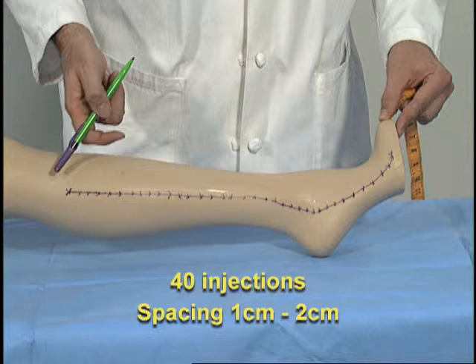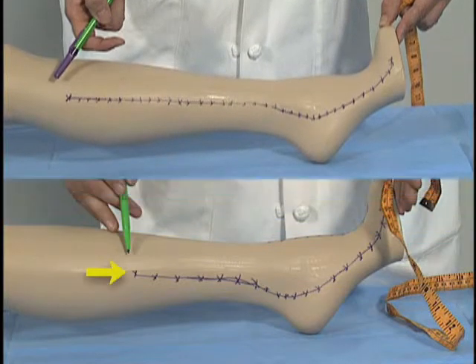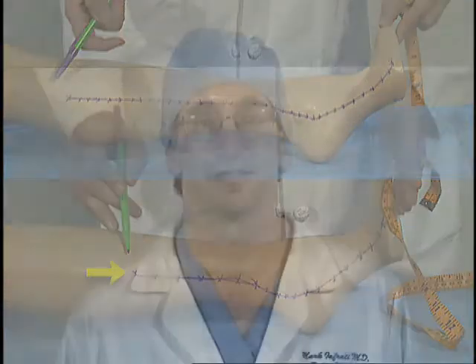Because the study protocol restricts you to 40 injections, you may not be able to cover the entire leg. In this situation, you should use your best clinical judgment to move your injection plane up or down to treat the areas of maximal ischemic gradient.